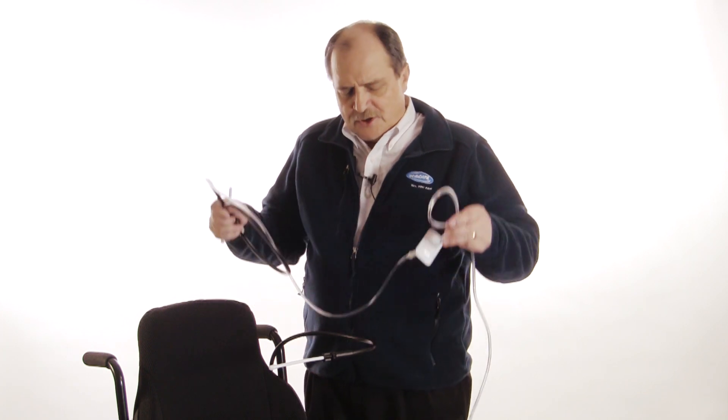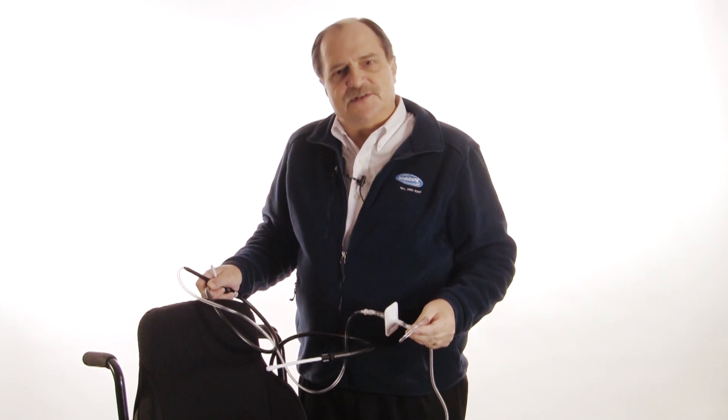Next, be very careful and pay attention to how you're setting up the system and mounting the components onto the power chair. Try to eliminate as much excess tubing as you can. The less volume of air the user has to move, the greater their chances for success.